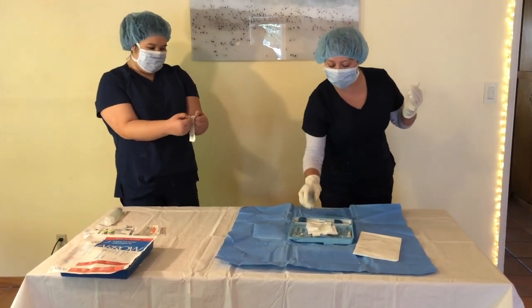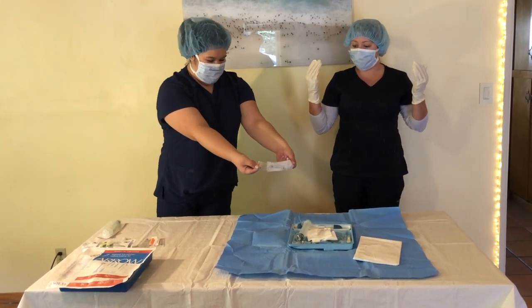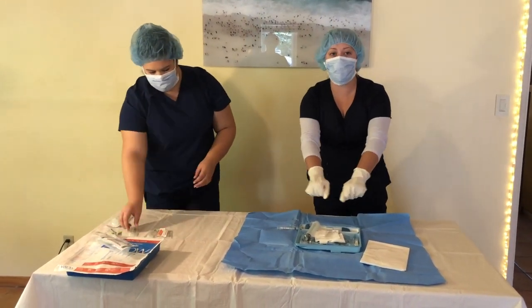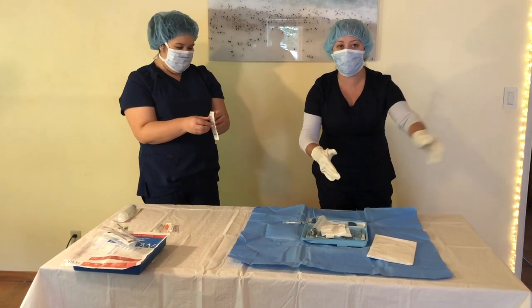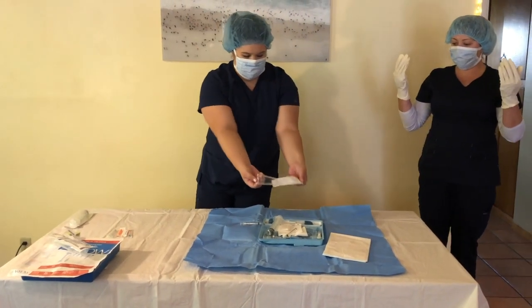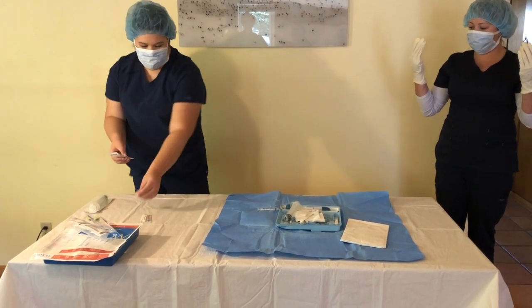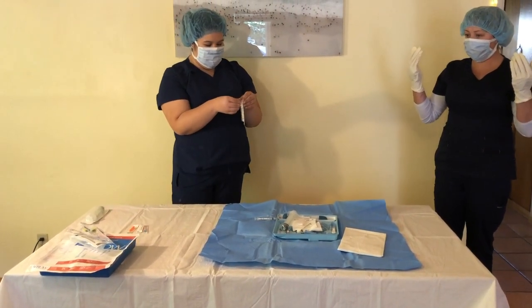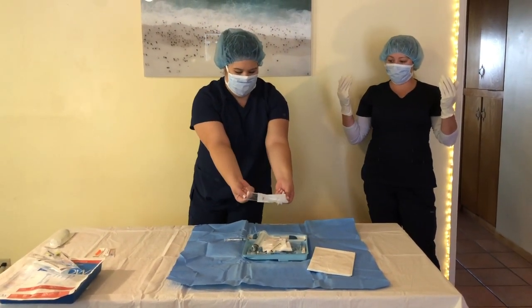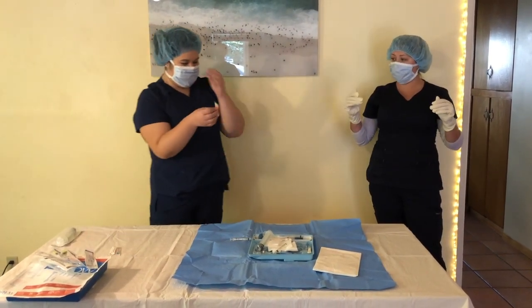Now I will grab this so that it's closer to the sterile field. You can grab. I want to do it closer. So with opening, you also want to make sure you're opening it right over the sterile tray so that there's less of a chance of it rolling out. Perfect. See how she's doing it away from her, so she's not touching the inside or anything.